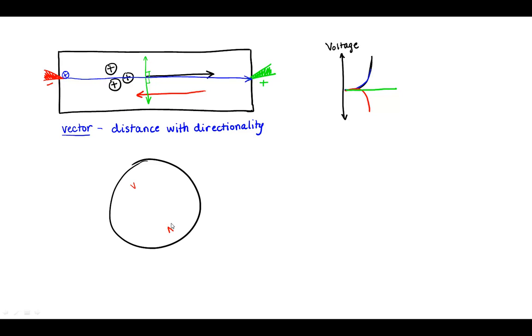And so what they do is, pretend this circle represents our patient, they would want not just one set of electrodes like this, but they would also like to see another set of electrodes like this, and another set of electrodes like this, and so on and so forth, until they had a bunch of different pairs that could read out different kinds of information. And using all of these different electrode pairs, the doctor would be able to get a very accurate picture of how charges move around inside of the heart, what direction they take, and so on.